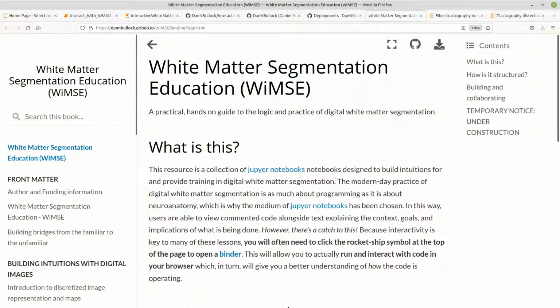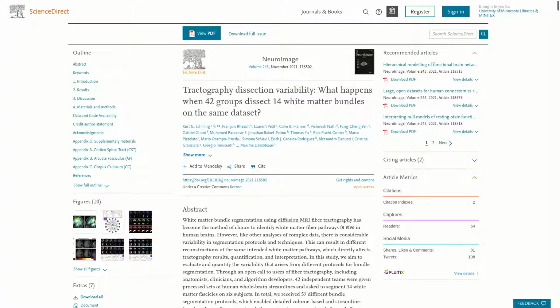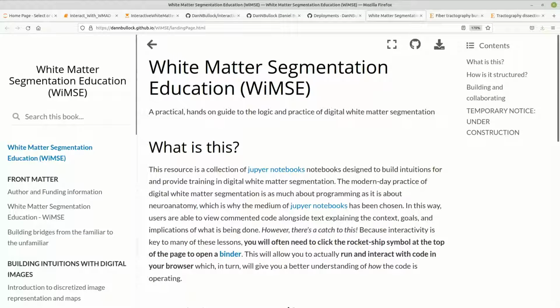In recent years, the utility of diffusion imaging and tractography has been demonstrated with investigations of behavioral associations, neurological disorders, and neurostimulation. Despite, or maybe even because of this increasing profile, a number of recent papers have commented on the pervasive obscurity surrounding methods in the field of white matter segmentation. This may be due to the range of bespoke approaches that arise from the apprenticeship style of training that is common in our niche field.